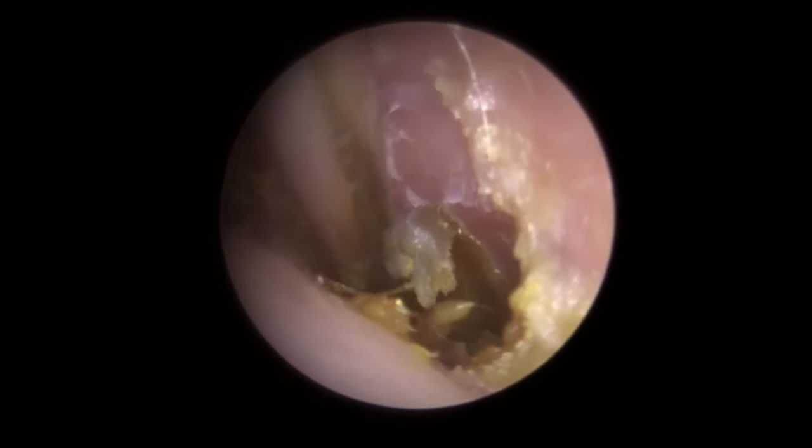Just get that little piece away there. There we go. Let's bring the suction along that one, try and take some of this away. There we go — and there we are. There's the eardrum, looking nice and healthy. Absolutely perfect. So you can see this was one continuous piece — two centimetres, just over three quarters of an inch there as well. Yeah, nice big piece, that one.